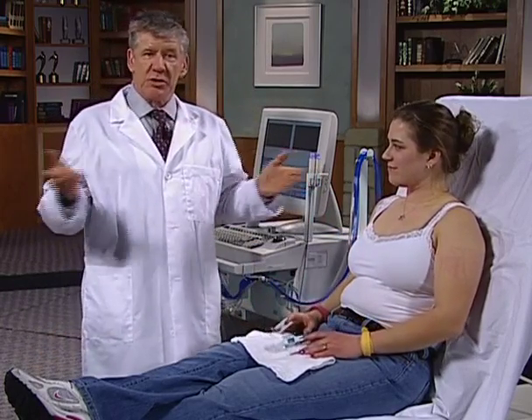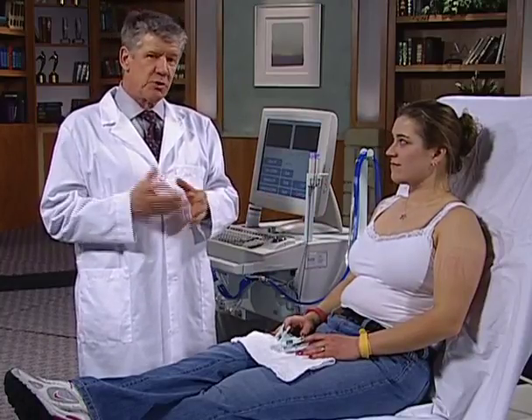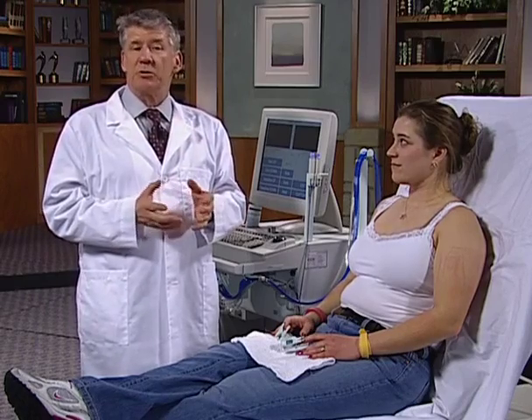So again, we can usually do this bilaterally, but for the sake of the demonstration, we're just using it unilaterally. For someone that truly has thoracic outlet, we'll see the PPG line go absolutely flat line.